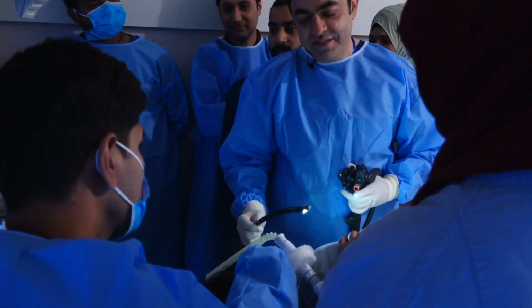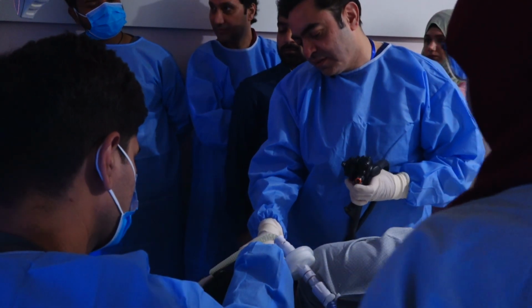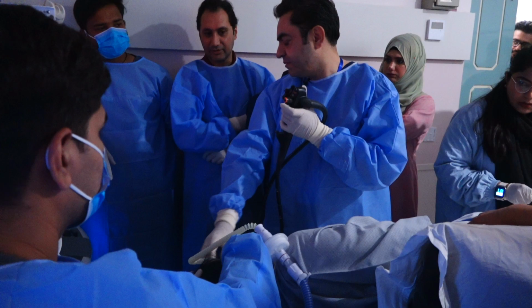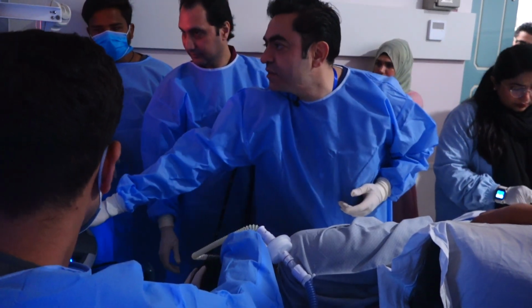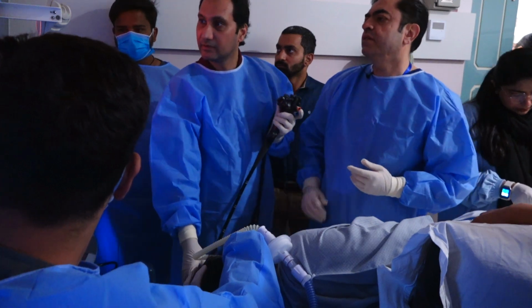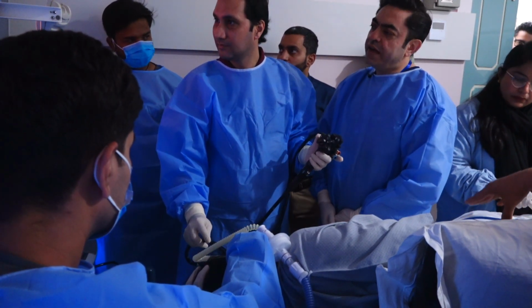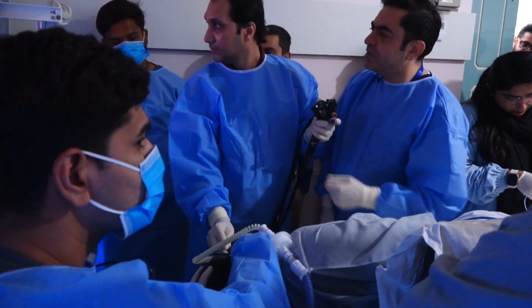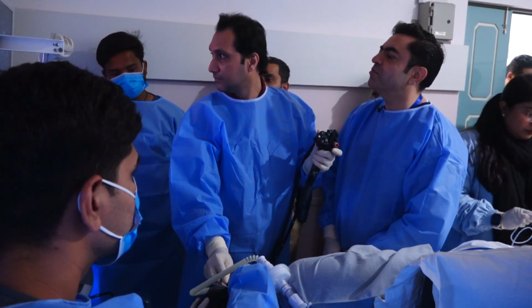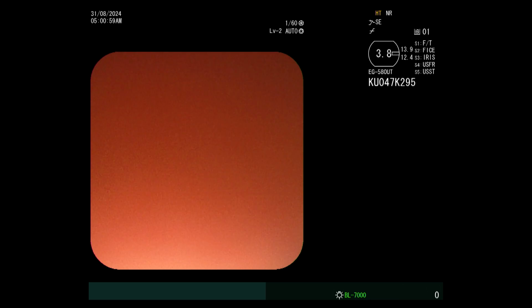Let's see, okay, let's start. We'll just see if we can get the scope in. Yep, so that's okay. At this point I'll just see. Okay, I tend to go directly to the GOJ by looking at the normal endoscopy image. Then we'll first interrogate the pancreas area and then we can come to the mediastinum, because you did the mediastinum yesterday.